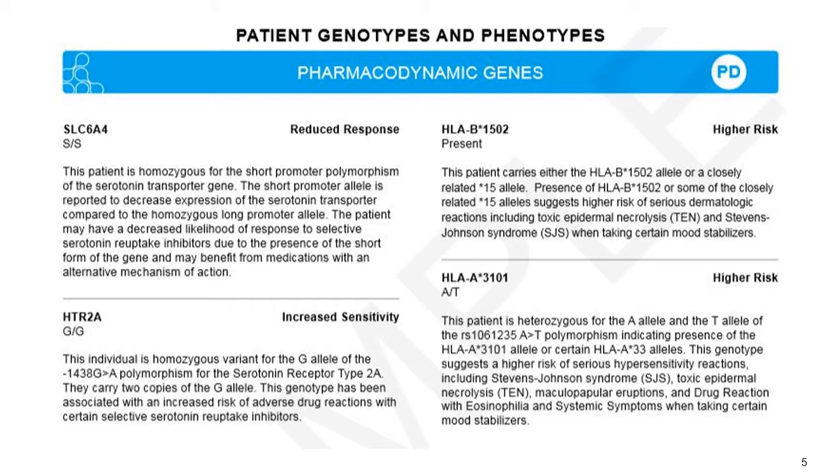And if you look, it is separated out: the bold is this particular gene, then you're looking at the genotype, and then this is the phenotype. And then they all have a short little paragraph underneath them to explain what this means for this particular patient.